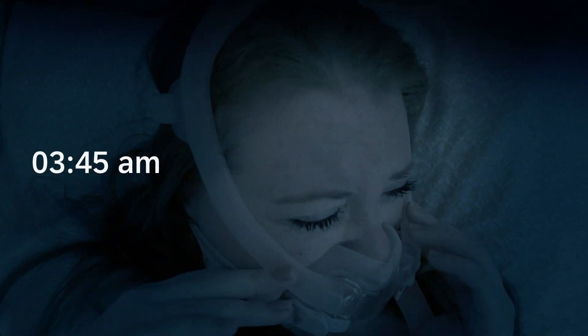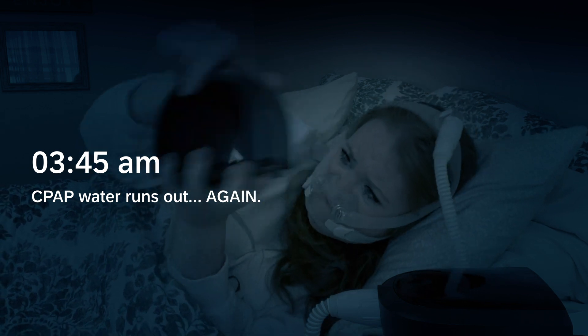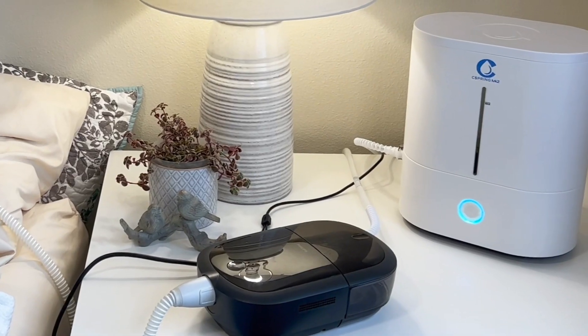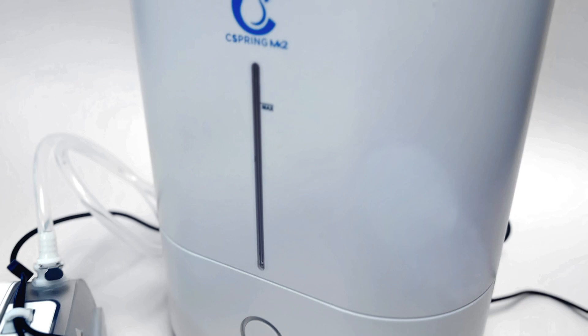Are you tired of waking up in the middle of the night to refill your CPAP humidifier water chamber? Don't let a dry water chamber ruin your night's sleep. Say hello to the CSpring Mk2, the ultimate solution to make your life easier and your sleep more restful.